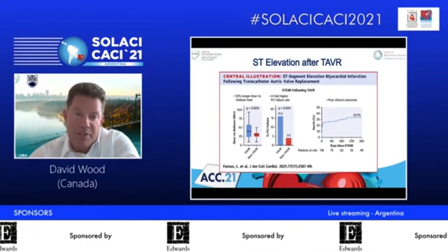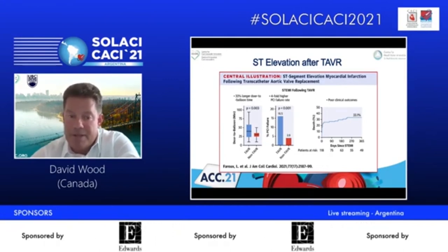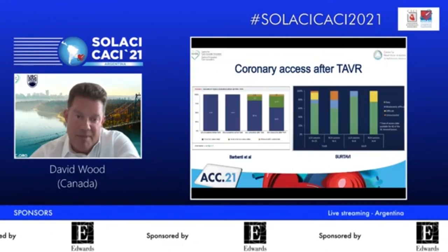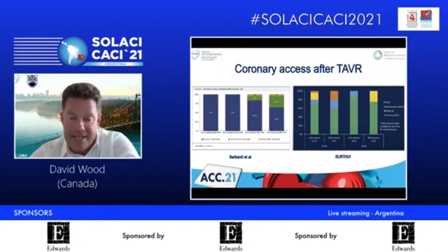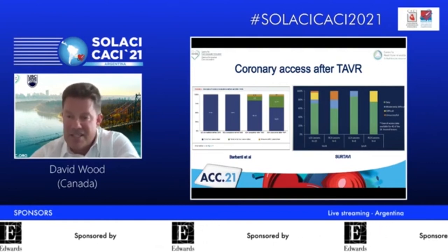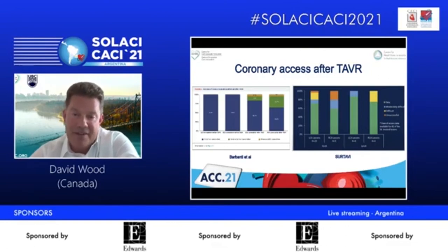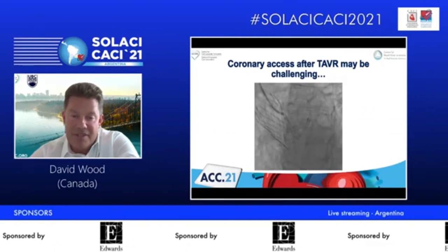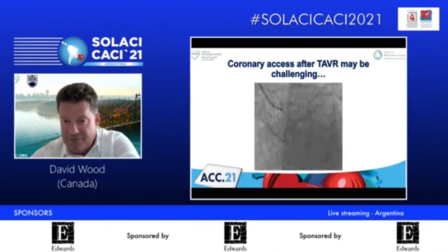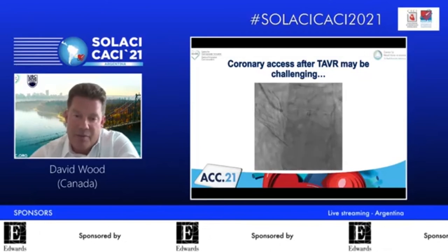We have a nice paper from this year telling us about door to balloon time, with a fourfold higher PCI failure rate when you have patients with a prior THV platform. And then Marco Barbanti, one of our former fellows, published this paper. This was talked about extensively at TVT. As you know, I think, goodness, half the cases involved coronary access and strategies at TVT. So we know that coronary access is going to be significant after TAVI. And I think all of us doing procedures frequently have had cases where both short and tall frame platforms have come back, and it was very challenging to access the coronaries.